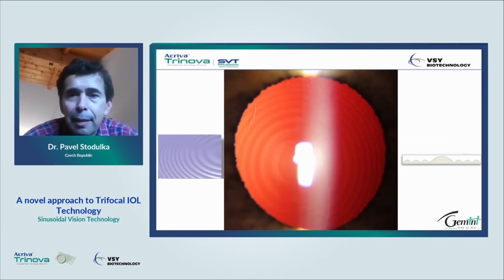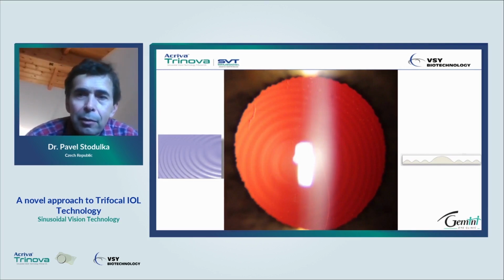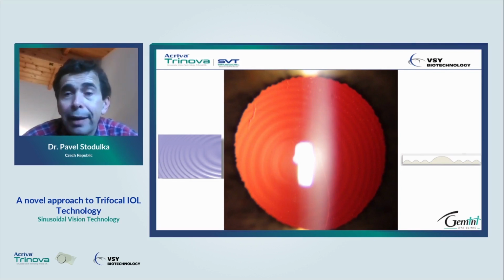And there is a picture with retro illumination, and you see on the side of the picture the theoretical profile of this lens, and then we see how it looks like in retro illumination. So if you look a little bit more in detail, that's a different picture compared to the other trifocal diffractive technology.